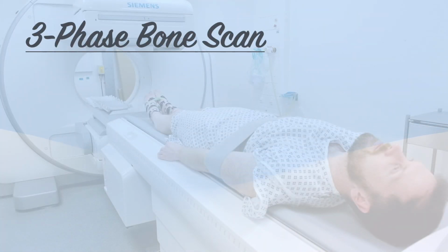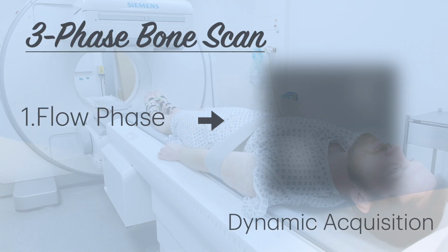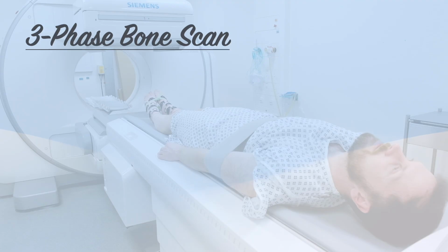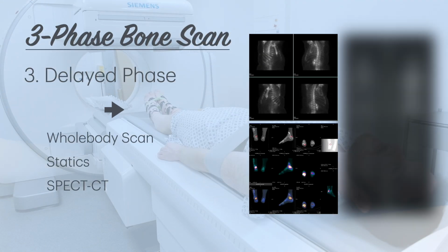Just to simplify, let's categorize them into two classifications: a standard bone scan and a three-phase bone scan. A three-phase bone scan starts with the flow phase, wherein the tracer HDP is injected while the area of interest is under the detector with the commencement of the dynamic acquisition. After 10 minutes, a static acquisition of the area of interest is acquired, which is also called the blood pool phase. The late phase is where we scan the patient under the scanner after a few hours from the time of injection.